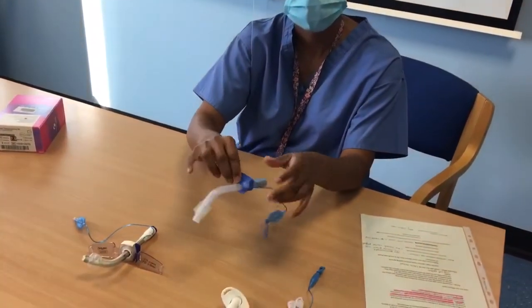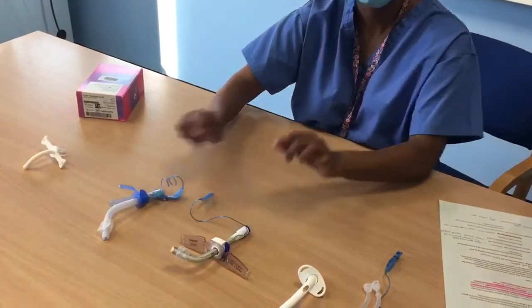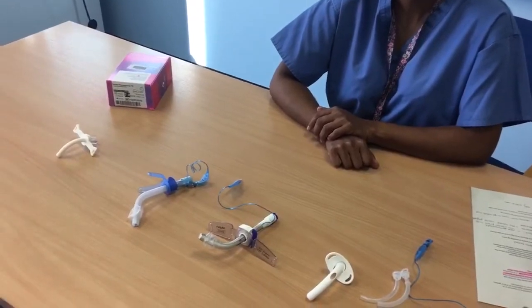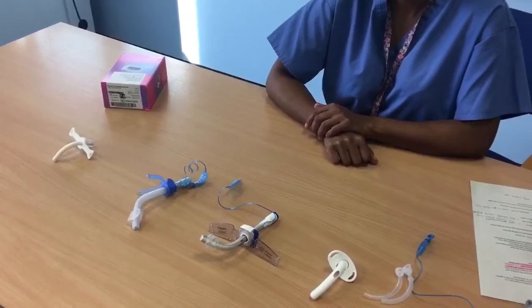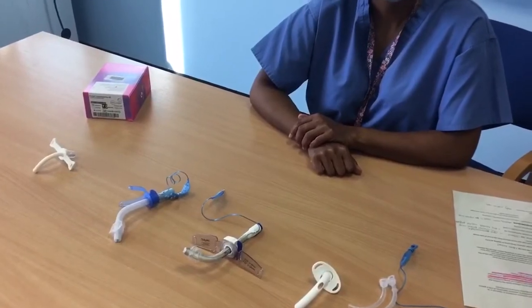And just to say as well that the length that the latch or screw is at is a decision by the medics. We don't ever adjust them, we just make sure that they're secure. And also these are put in surgery rather than in the bed space. Even in critical care, the patient would go to theatre to get these types of tracheostomies inserted.